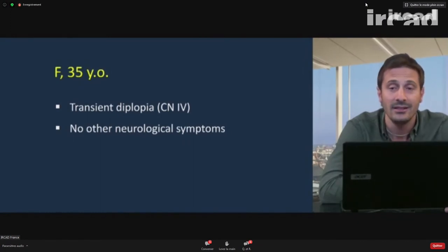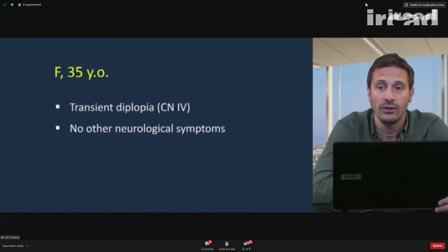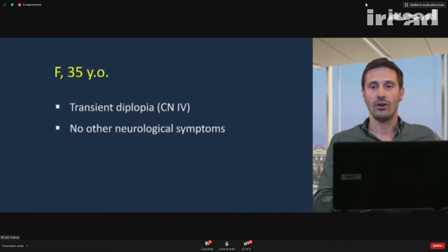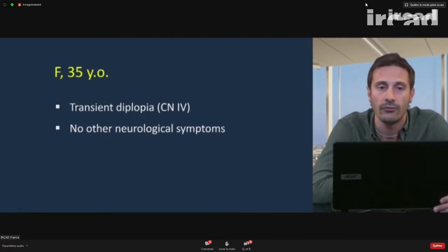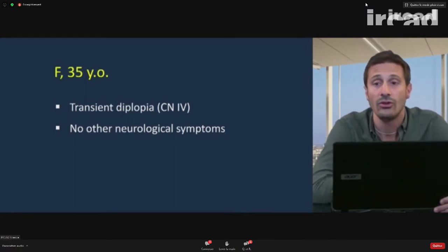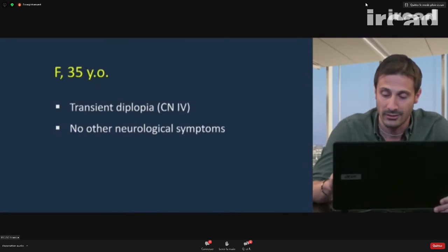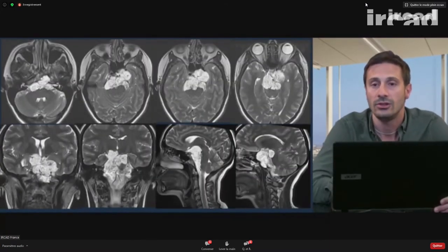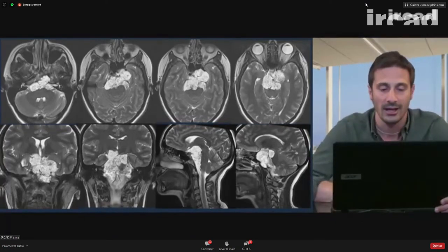So this was a young lady, 35 years old. She presented to us with just very mild symptoms, because she had only transient diplopia, mainly derived from a palsy of a fourth cranial nerve, and she had no other neurological symptoms, nothing. So this is the MRI that she showed to us. So as you can see, this is really a huge tumor.